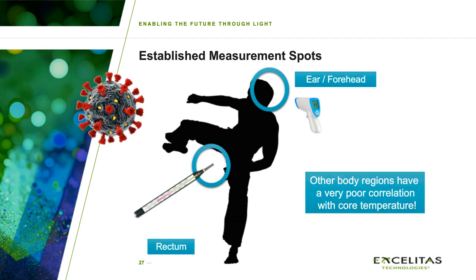Other regions you may consider using, like the wrists, or some wearables, some stuff which you have around the neck, and so on. I can tell you from experience, this has been tried many, many times, and those regions all over the place only correlate poorly with the core body temperature. And what we're interested in is the core body temperature and not the surface temperature of the person.